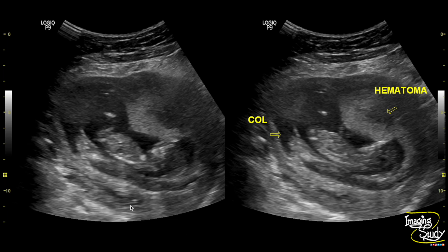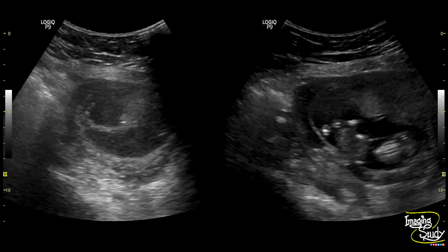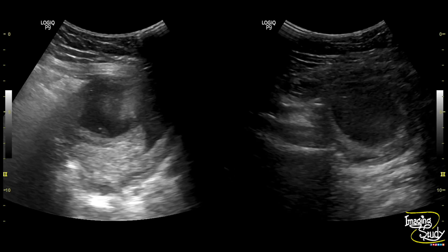Here is a picture showing the fetus, and you can see this anechoic crescent-shaped area extending up to the placental margin. Here again is the picture showing the collection between the chorionic membrane and the uterine wall. In another picture on the left, you can see the collection extending up to the other part of the placental margin — this anechoic cystic area is not the gestational sac; rather, it is the collection.